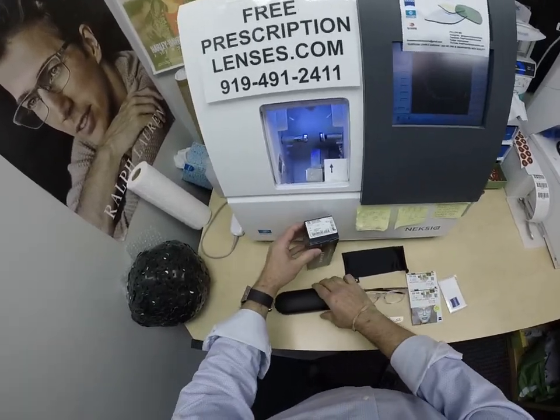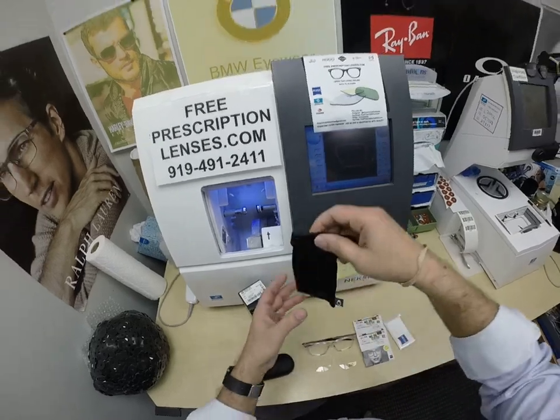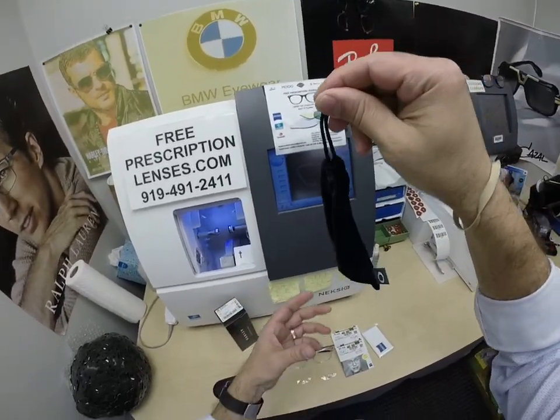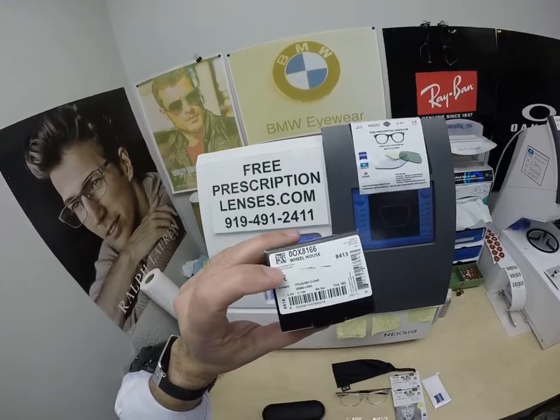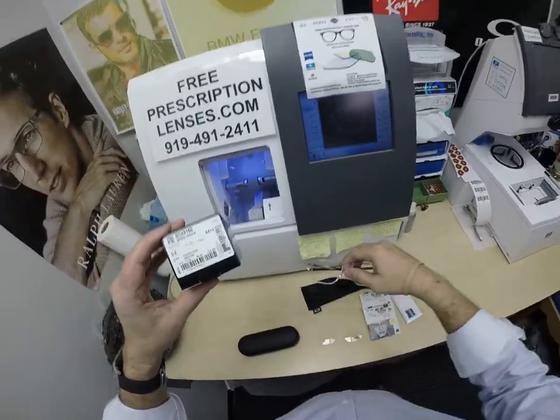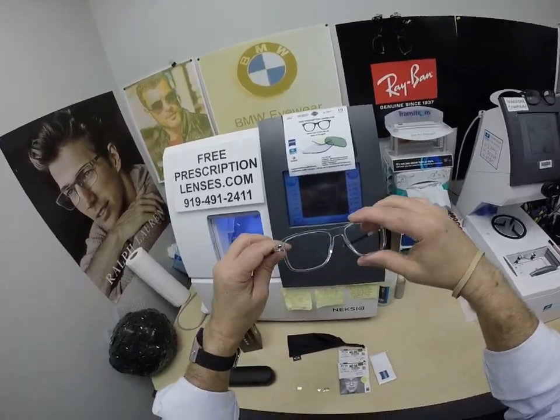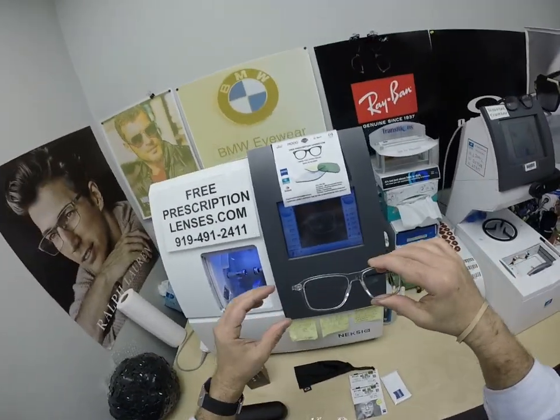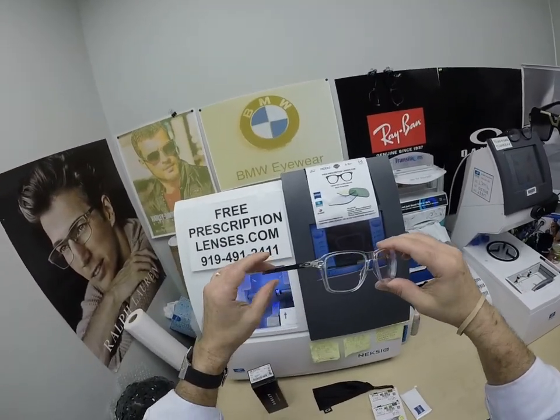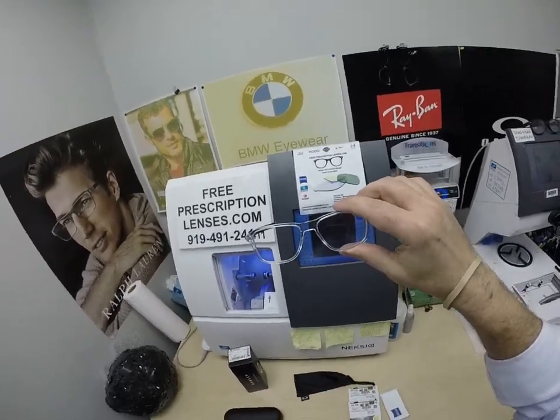The frame comes with the hard shell case. It comes with the cleaning cloth slash carrying bag if you don't want to carry around the hard case. This frame comes in four colors: the polished clear that you see here, a black, a brown, and a gray smoke. It comes with the original demo lenses and all the manufacturer's original packaging. It comes in a 52 and a 54 eye size in all four colors.